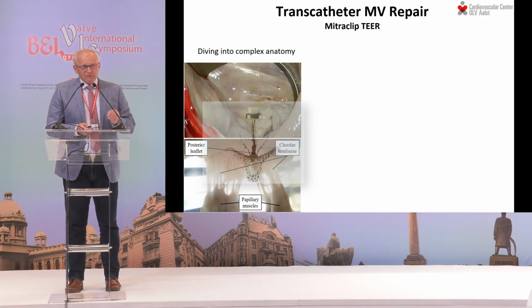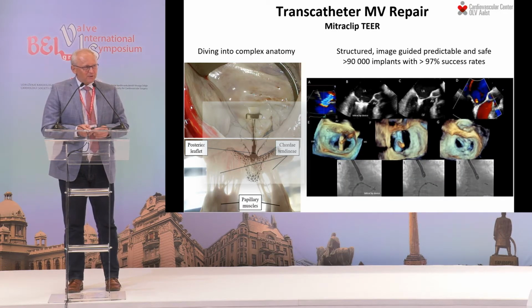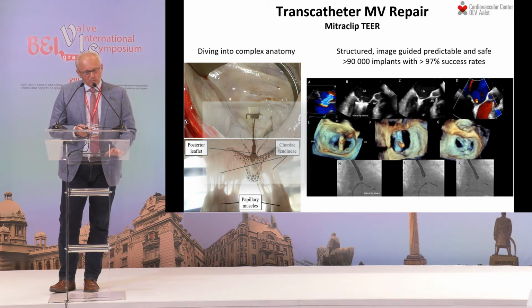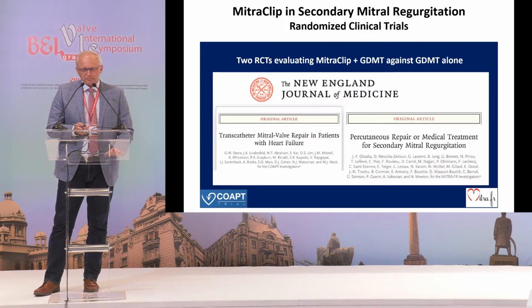I think we have to definitely acknowledge the fact that the MitraClip procedure is very structured. It's image-guided, predictable, and safe. I think that's a very important first step when we are talking about percutaneous interventions. There's huge experience, as I said, with high success rates. So technically, I think this is teachable, this is adoptable, I would say, in routine clinical practice, in routine cath labs.